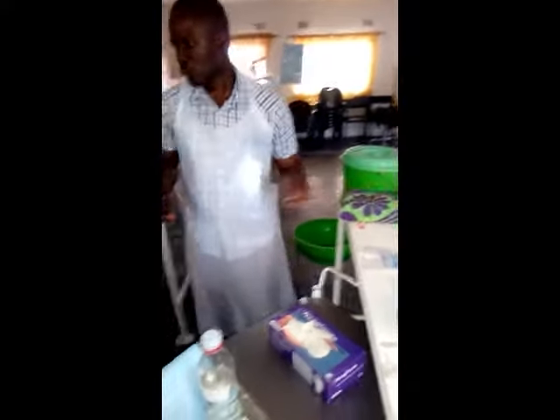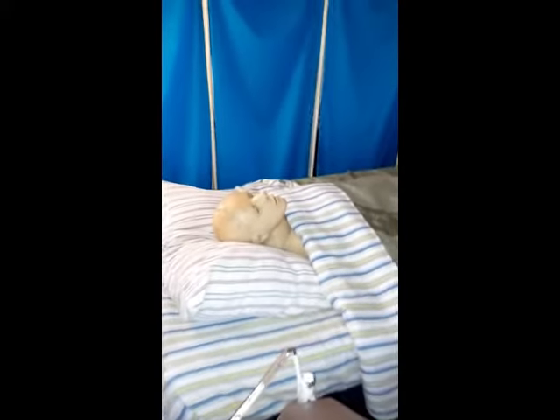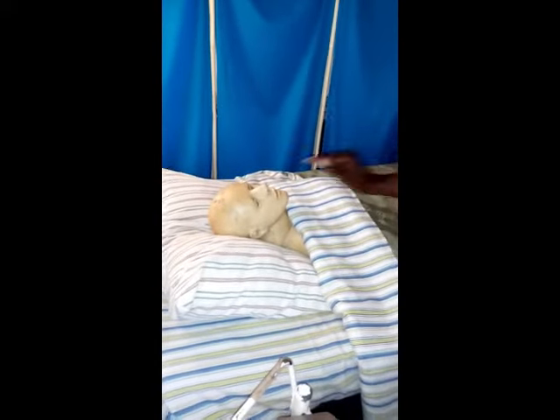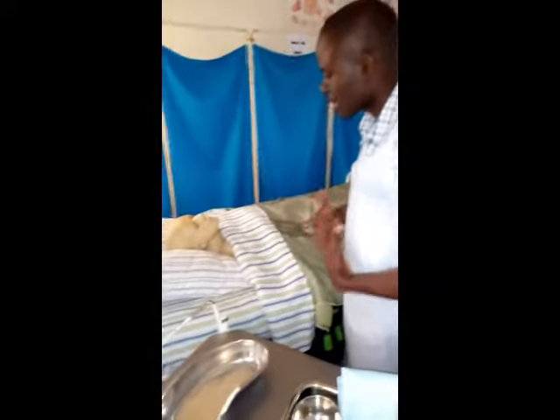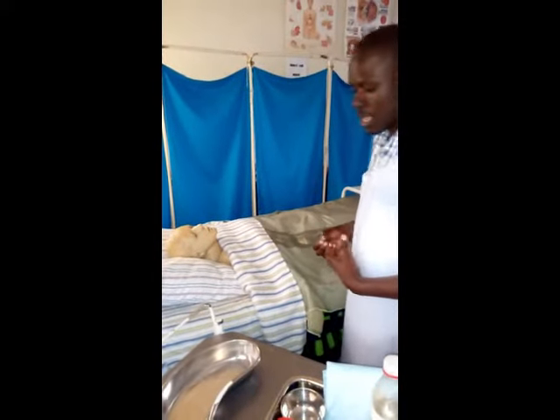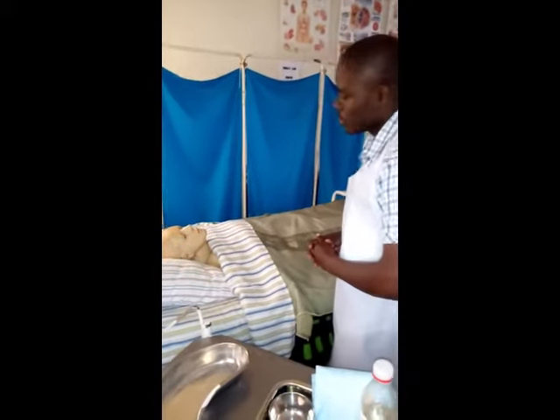Then you come to Mrs. Mwape. Mrs. Mwape, good afternoon. Mrs. Mwape has responded, she's fine. Mrs. Mwape, I am Collins, come to insert an NG tube, which is a nasogastric tube. This tube will be inserted through your nose to the stomach. It will be a little bit uncomfortable, but we will make sure you are comfortable as we insert the tube. As of now, we're going to ask you to sit up as we insert the tube. That's the first important thing.